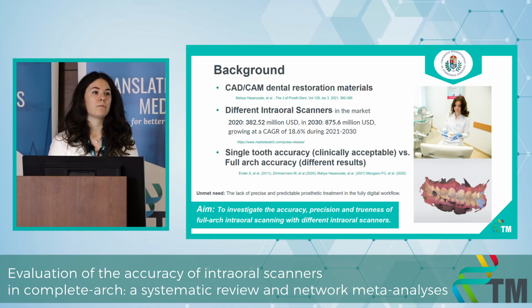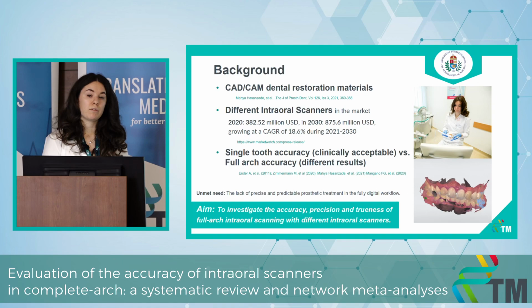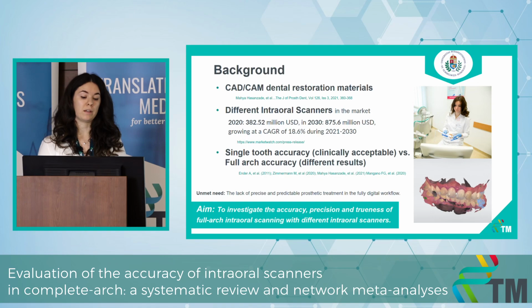meta-analysis. Some of the dental restorations can only be manufactured with CAD/CAM technology, which is computer-aided design, computer-aided manufacturing technology. And to use this kind of digital technology, we always need to have a 3-dimensional file, which is an STL file usually. And to gain this file, we need intraoral scanners or other scanners to make it.